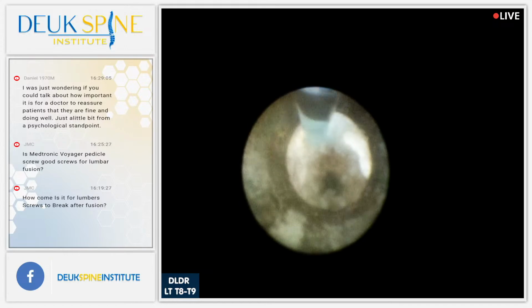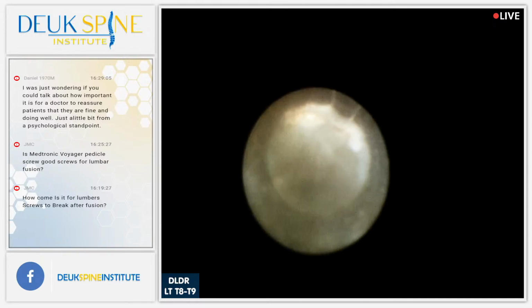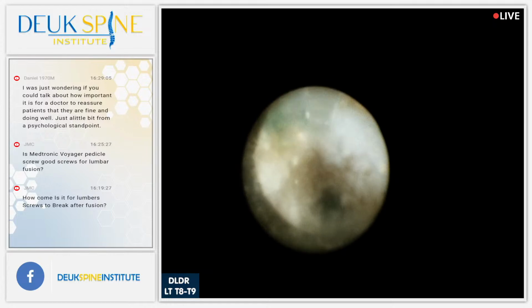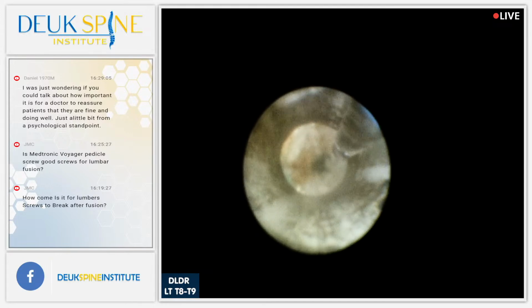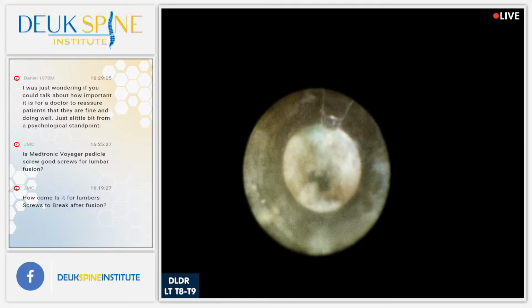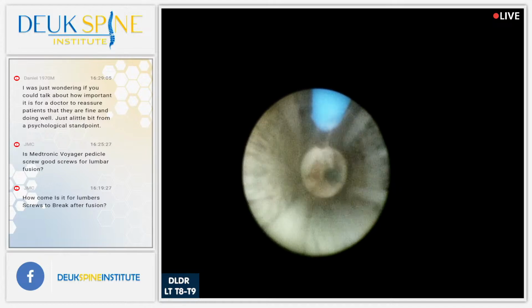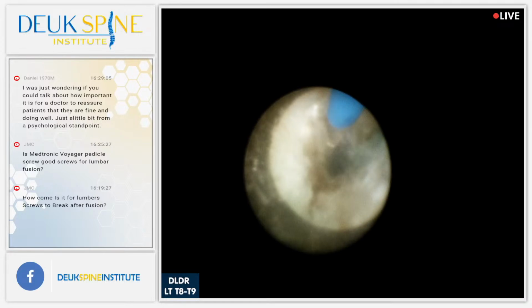I used them about 21, 22, 23, 24. There's calcium right there. There's bone spur. I just zapped it away 25 years ago. And sure, they've probably changed a few things, but I don't think they've changed that much. Anyway, back then I wouldn't use it because I found that other companies made better equipment. And I switched to those other companies and I use them currently. That's just kind of surgeon preference, but I think it makes a difference.